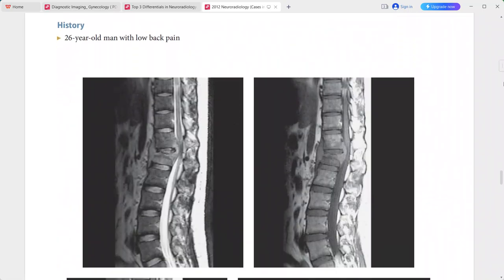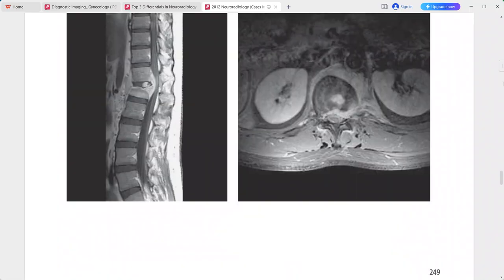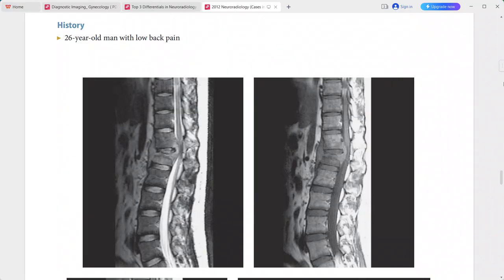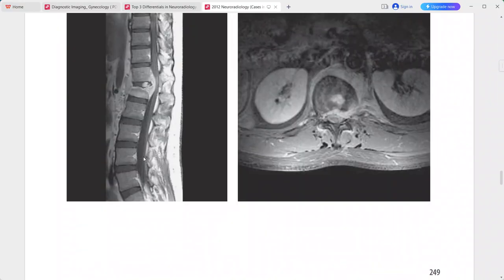Next is a 26-year-old patient presenting with low back pain. There is superior end plate compression deformity at L1, and a soft tissue mass surrounding the T12 and L1 vertebral bodies and the intervening disc space. This mass is hyperintense on T2 and enhances uniformly after contrast. The ventral epidural component is displacing the thecal sac.